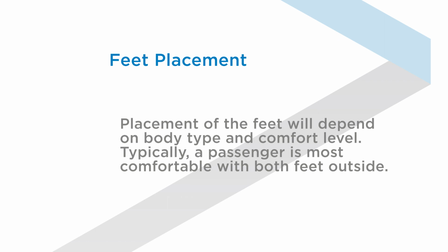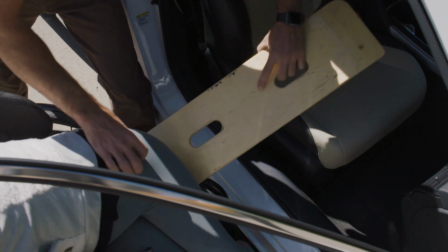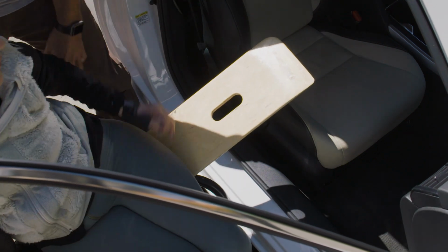Placement of the feet will depend on body type and comfort level. Typically, a passenger is most comfortable with both feet outside of the car. Now, the passenger will lean in the opposite direction of the transfer. About 1/3 of the board is placed underneath the thigh.